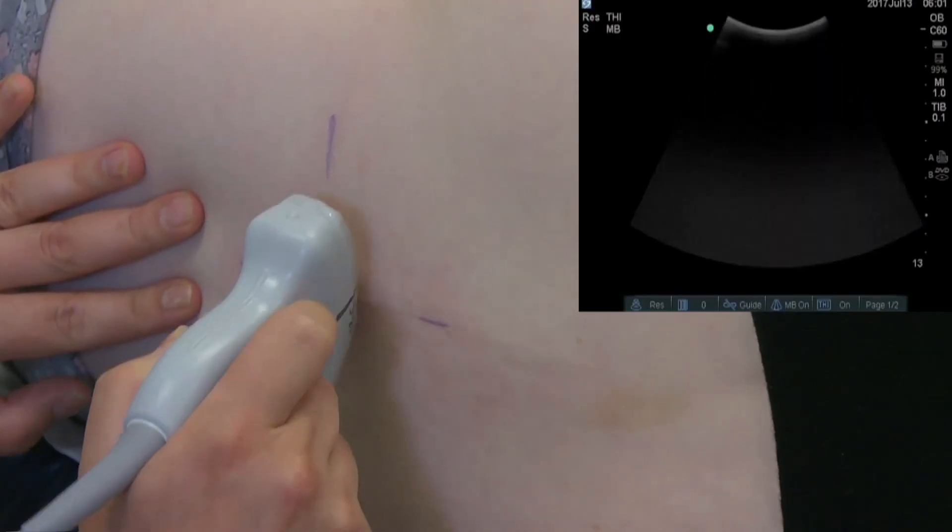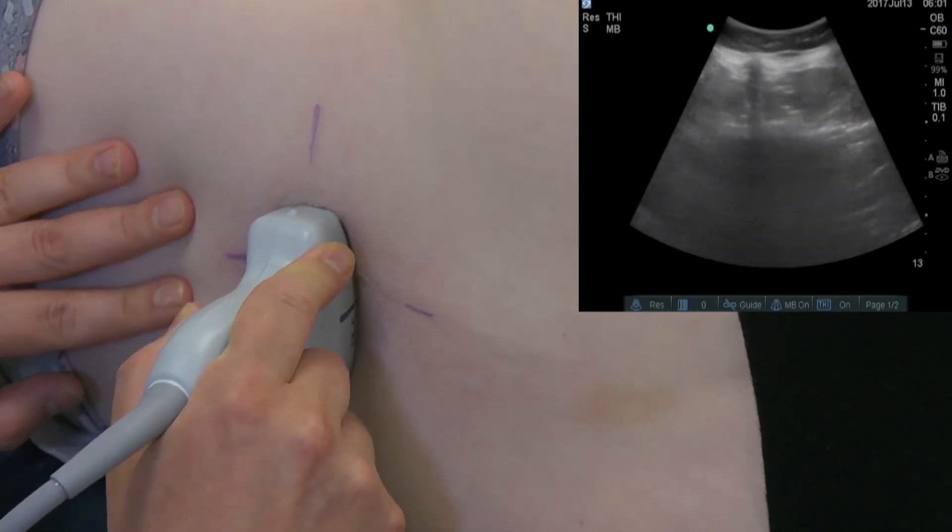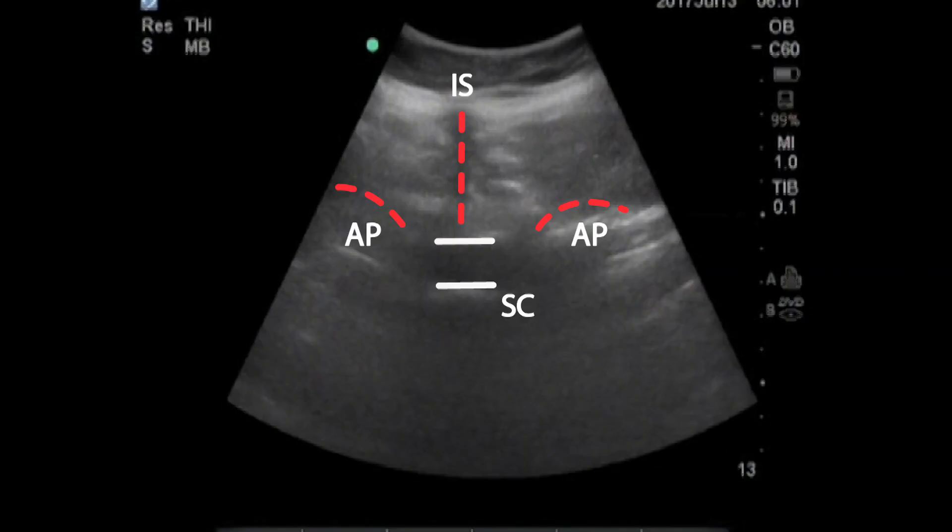Next, rotate the transducer by 90 degrees and check in the transverse plane. Align the probe looking through the interspinous ligament. The spinal canal can be seen deep to and between the articular processes.